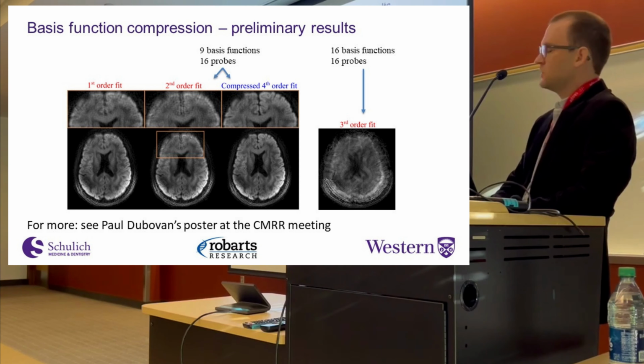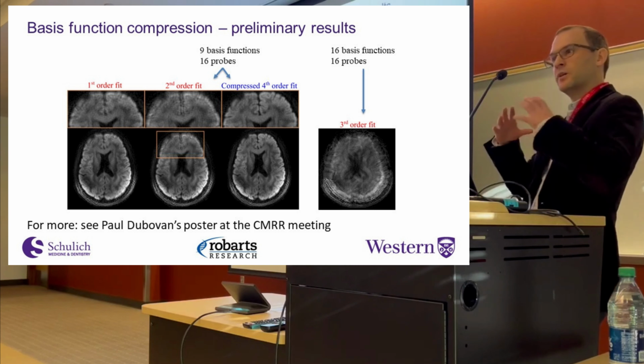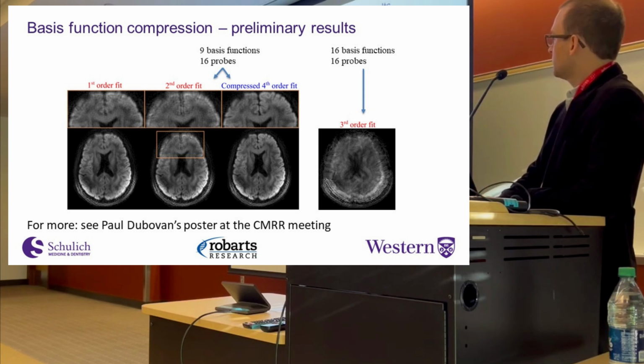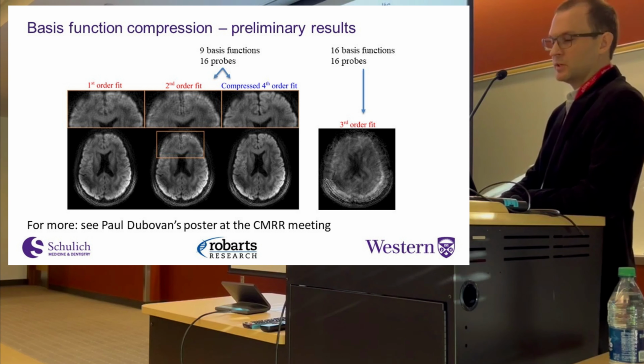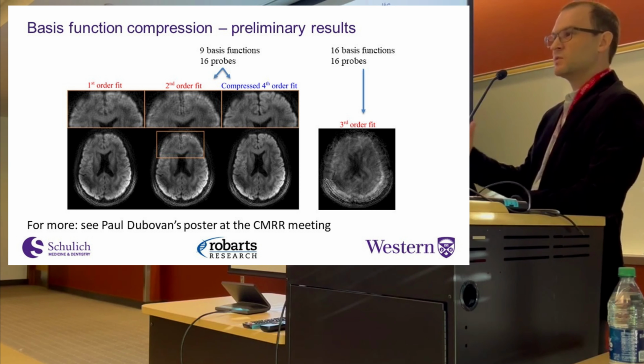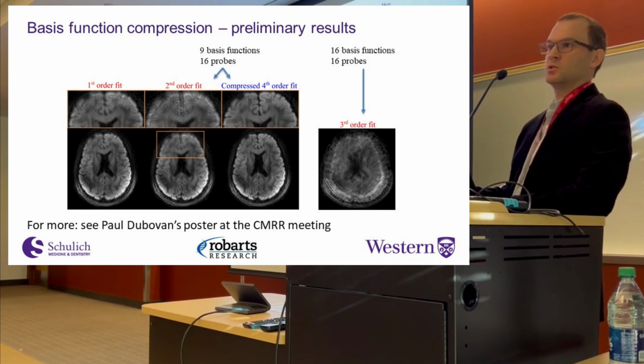This is on our 7T, where things get crazy and the higher orders have a bad impact. A first order fit is not so great. The second order fit is still very blurry. And the third order fit is garbage. And again, this is just in one DWI. Here it looks like it's getting worse as you go to higher orders, but that's because we're using spherical harmonics that don't actually describe our system well.